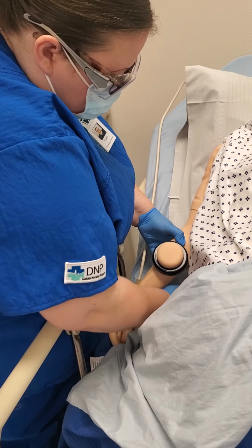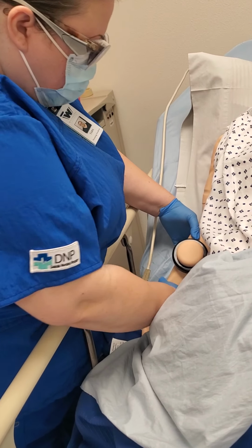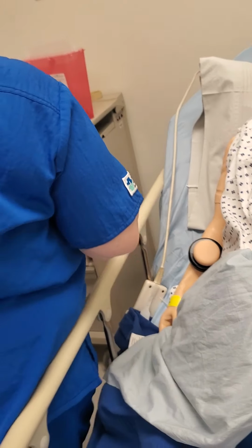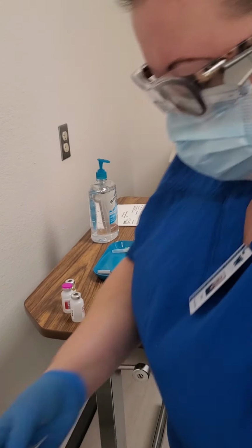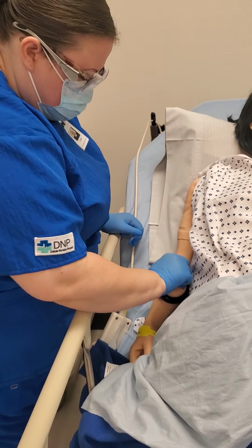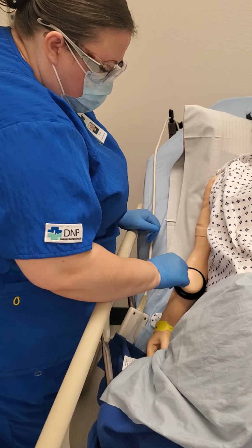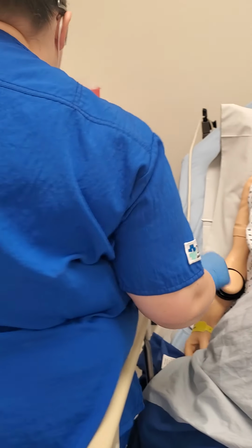On her inner forearm. Okay. I'm gonna take my alcohol swab and sanitize for my 15 to 20 seconds. And this is a TB test, Shirley.